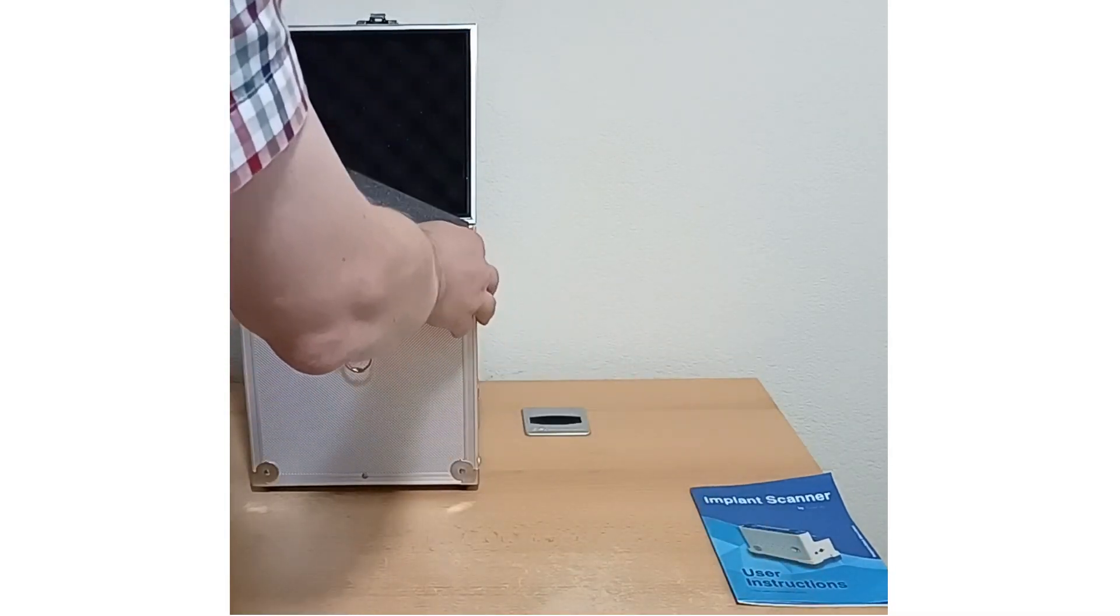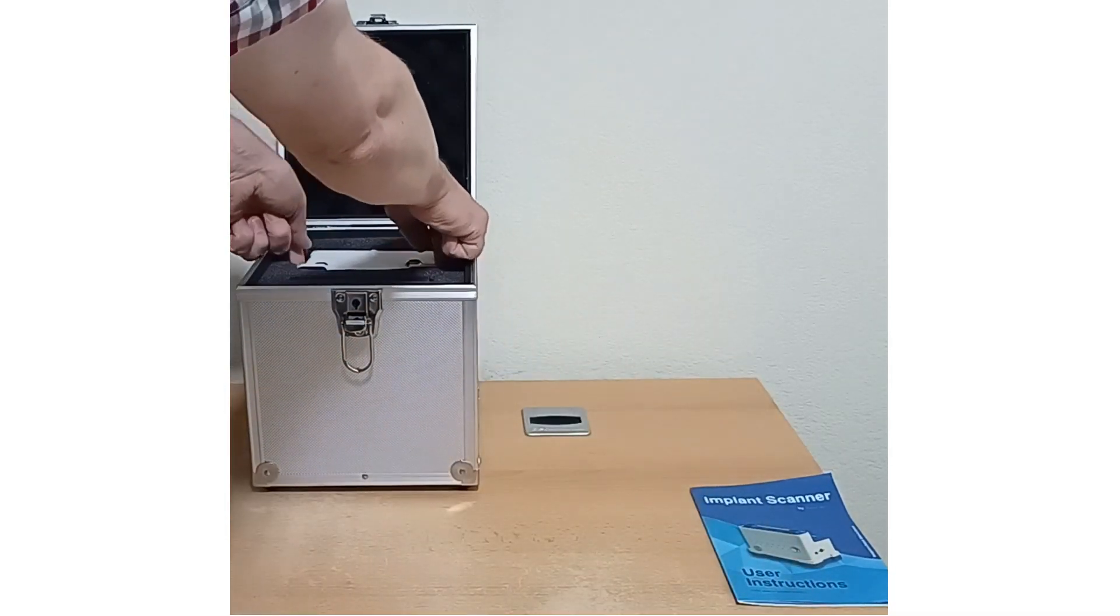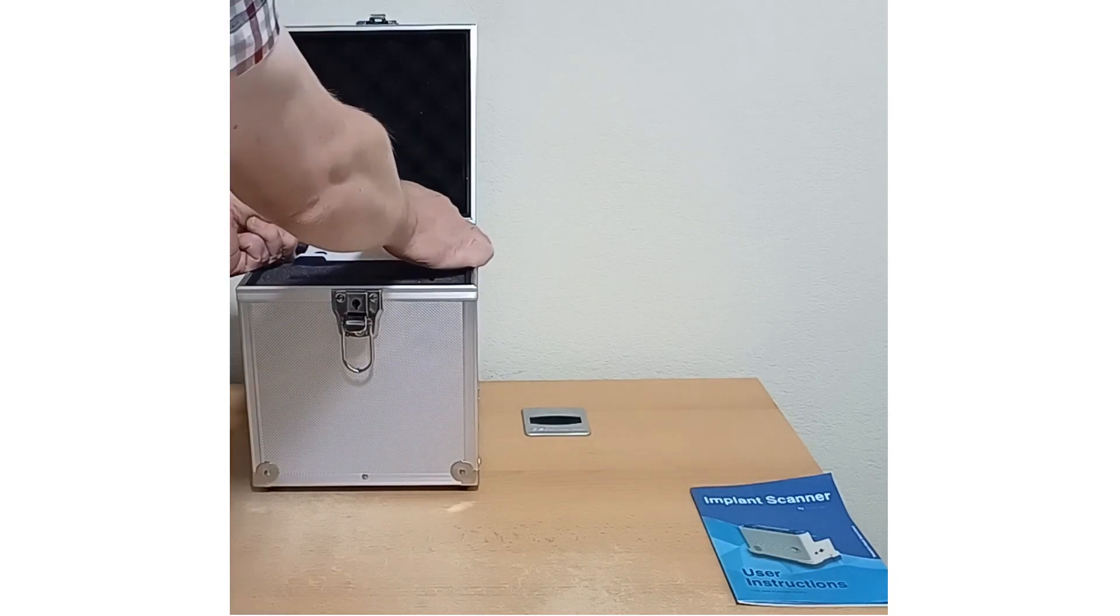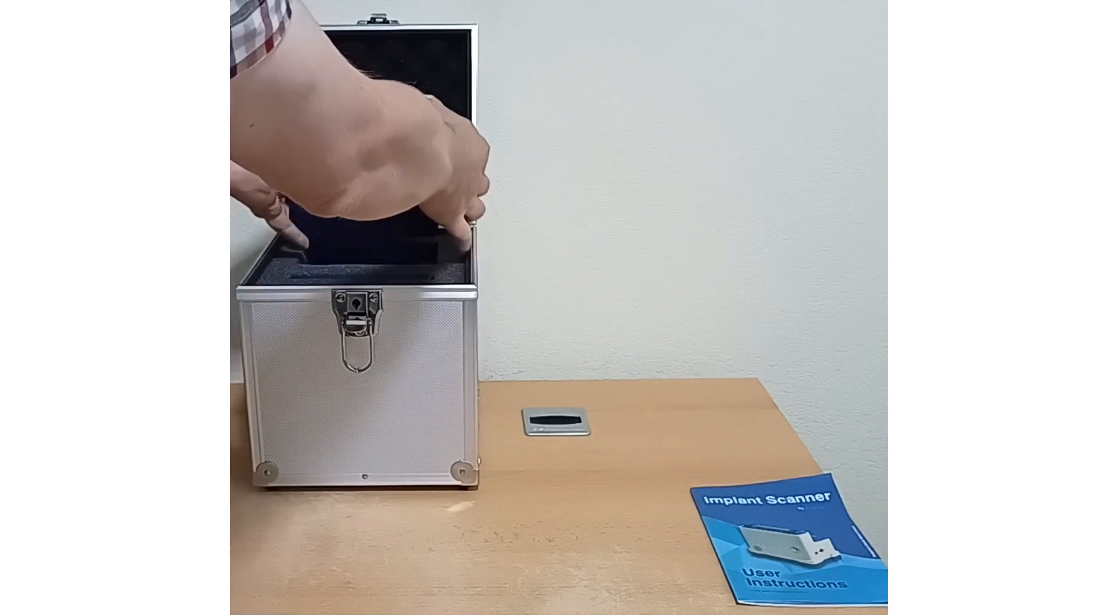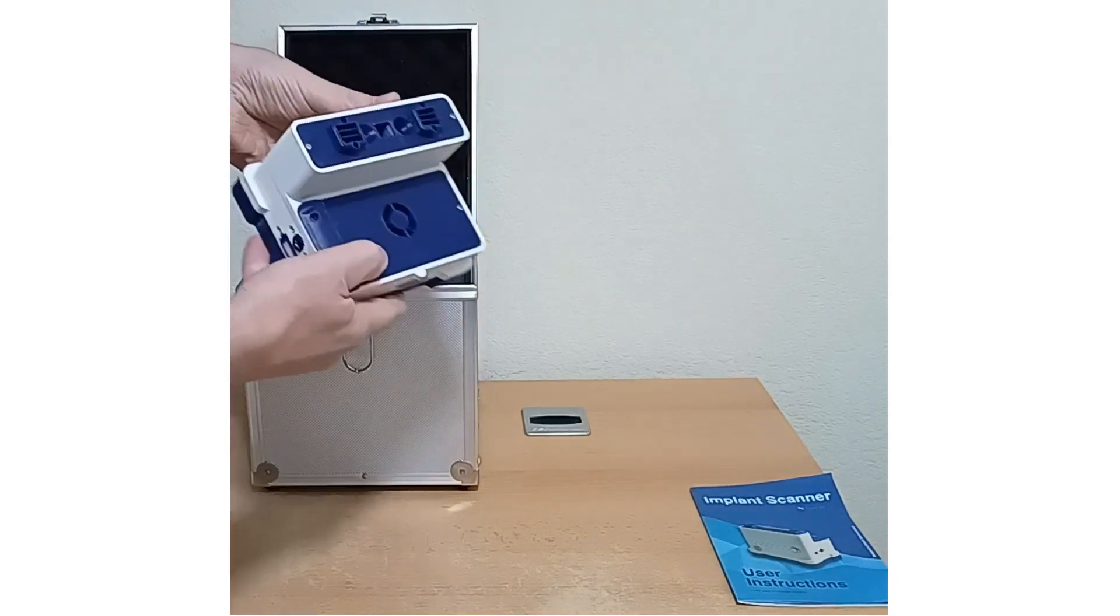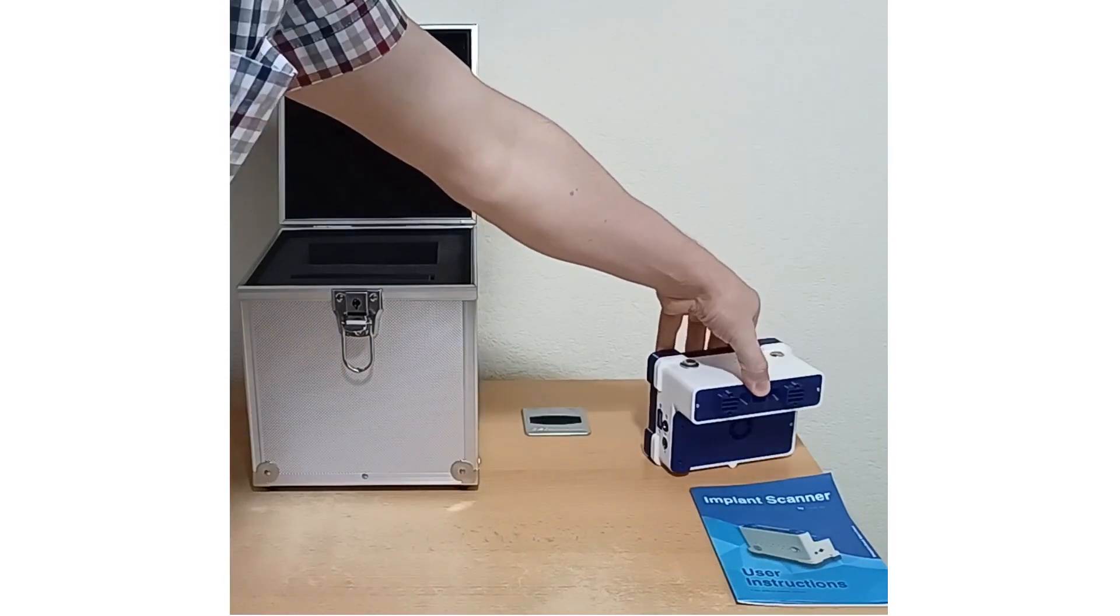You get the instruction manual, the scanner, and the calibration plate, all nicely protected in foam.